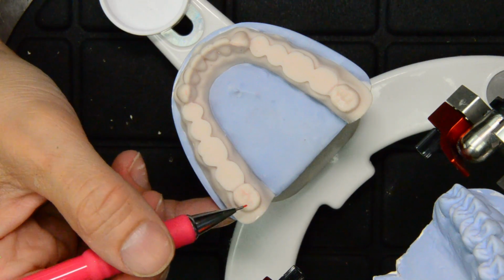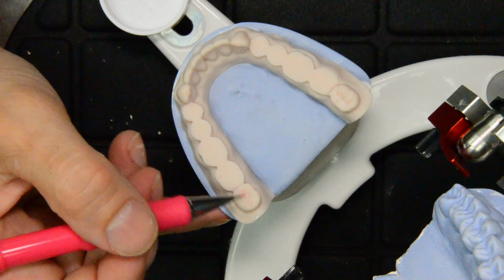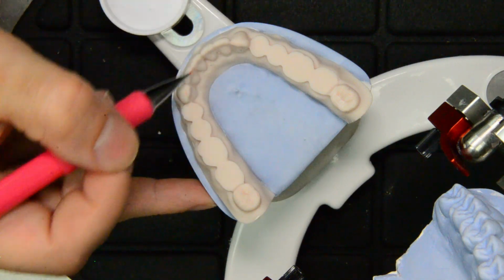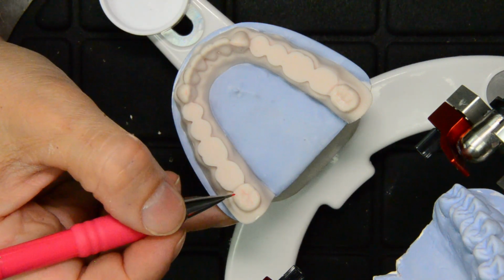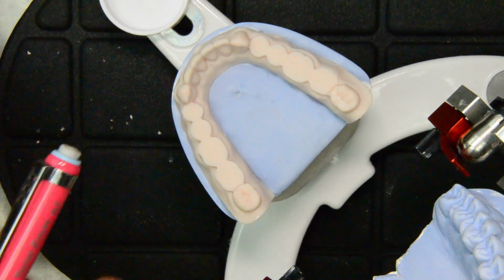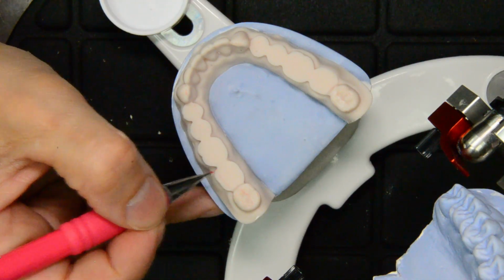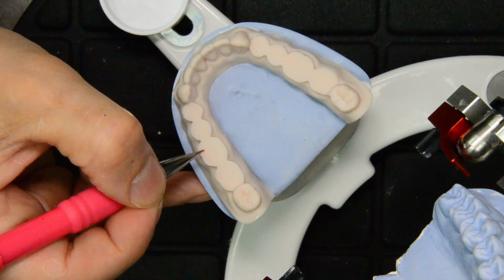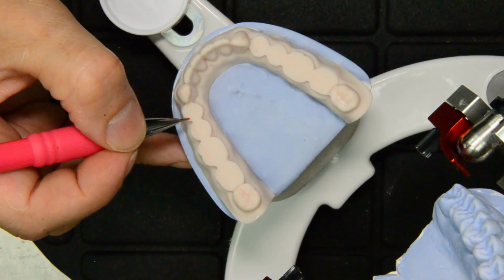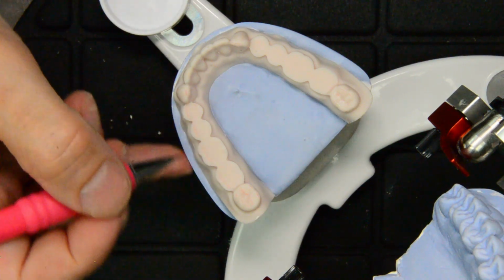So what we're going to do is draw the buccal reference line according to the buccal cusps. Now this line will flow on a slight curve since this is an arch form. We have a slight arch here and then a sharper arch in the front. So the reference line starts from the buccal cusp tips of the third molar, and we just continue through towards the cusp tip of the canine.